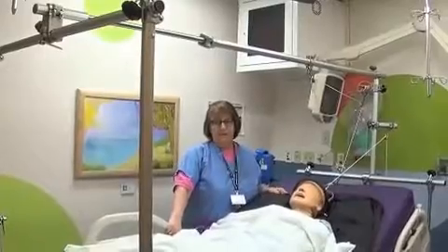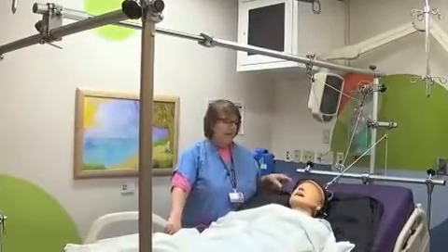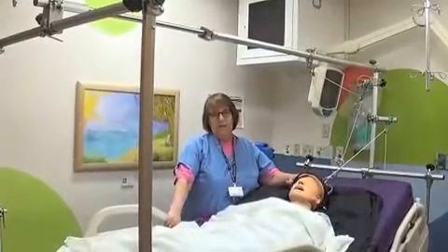Hello, I'm Nancy Blame. I'm one of the certified orthopedic technologists at Boston Children's Hospital, and today I want to discuss taking care of the patient who is in in-bed halo traction.